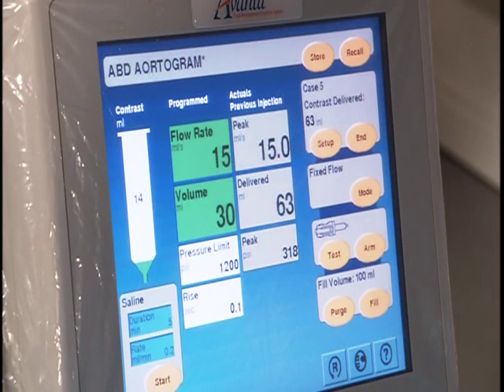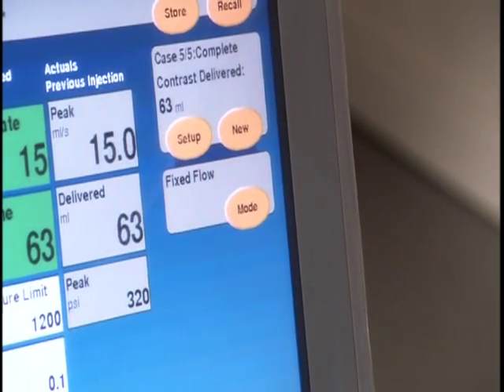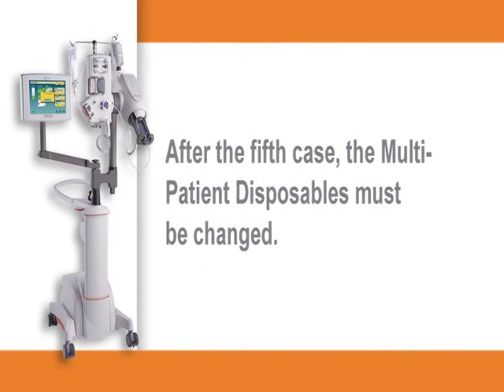To perform the initial setup of the Avanta fluid management system, simply touch End to confirm that the last case has ended, then touch New to begin a new case. Note that the protocol screen indicates how many cases have been performed. After the 5th case, the multi-patient disposables must be changed.